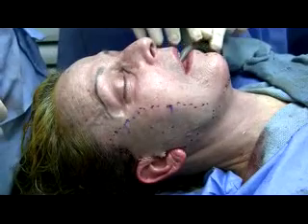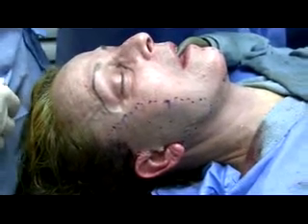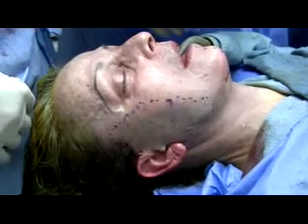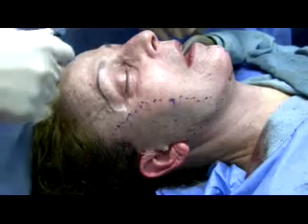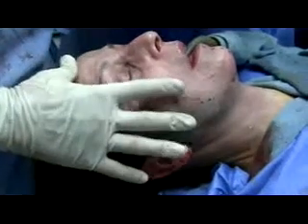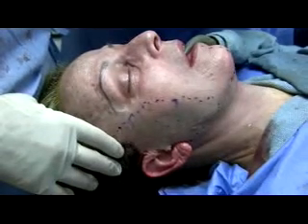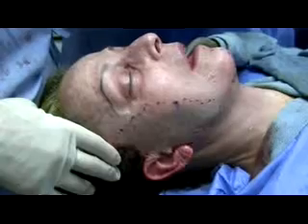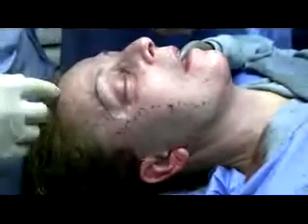All right, very good. Laser resurfacing settings. And my recommendation would be that no one should really laser a facelift simultaneously unless you have a lot of laser experience and a lot of facelift experience, because there are a lot of fine points that have to be taken into consideration, and you don't want to have these complications. We're going to laser the central oval of the face quite aggressively.